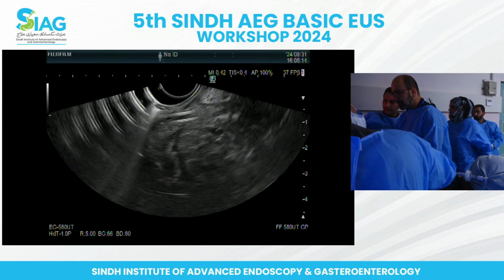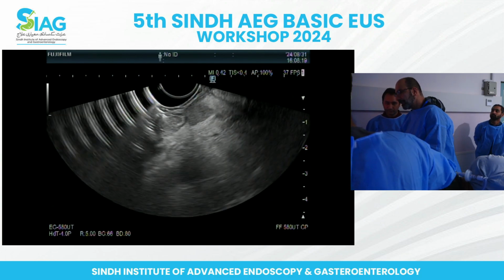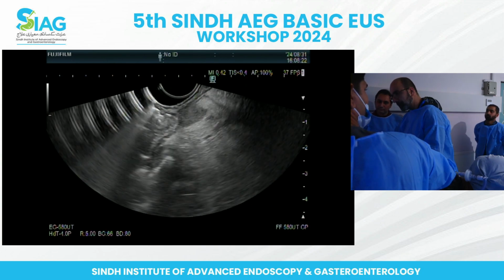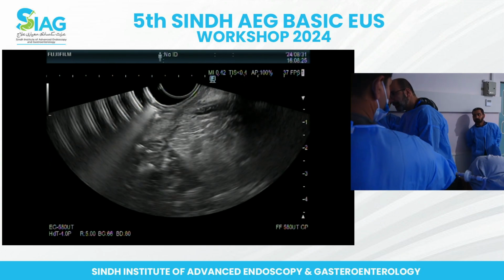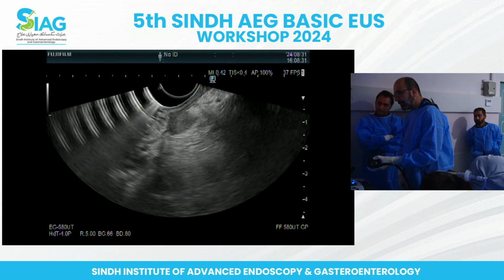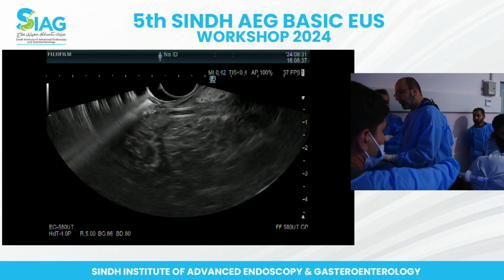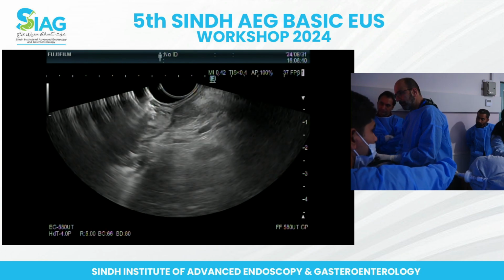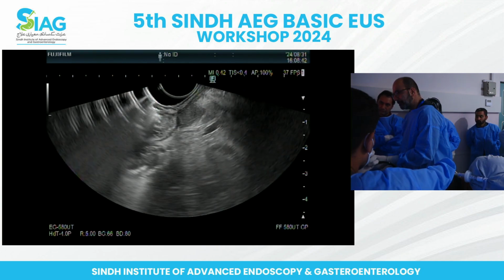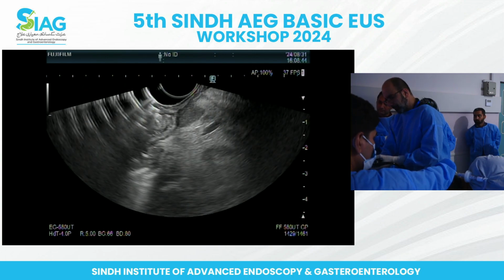There's a lot of thickening of the CBD as well. Yeah, but that's post procedure, so I think that. But this looks inside. So we can. Not that I can make out with a stent. That's a good question, but I don't know if right there it's traversing the intraductal component. So I think we want to target this area. So that clearly looks deeper than the muscular. This is the MP. So what is this rounded area?